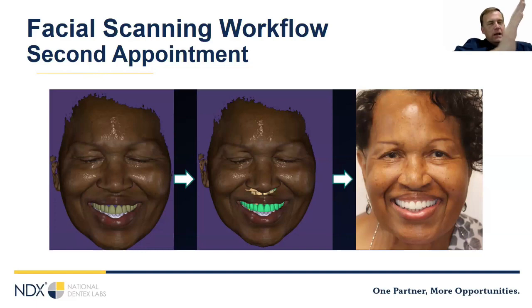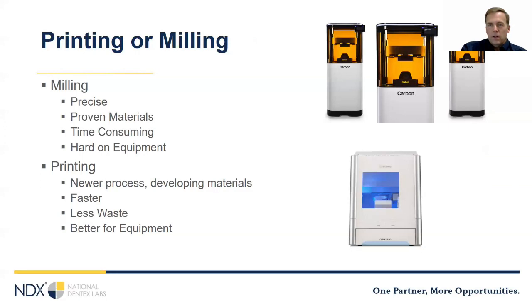If you turn the 3D view exactly the same way the patient is sitting in the chair, it looks exactly the same. So I think that there's going to come a day where we're like, well, this is goofy. I wonder why we ever did things without a facial scan. So I think this is going to make a huge difference in dentistry as we're moving forward.